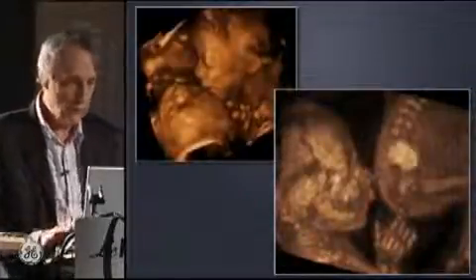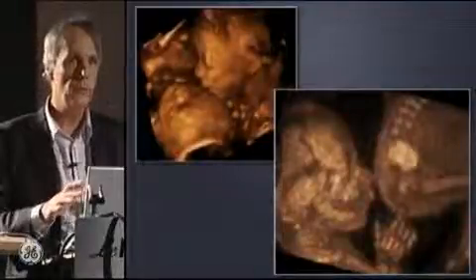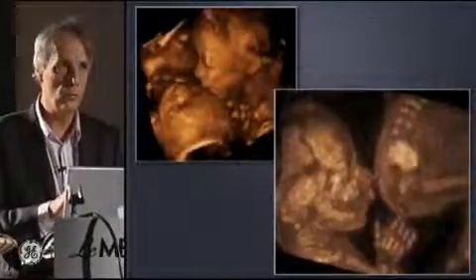So this was a lecture on the use of 3D ultrasound in obstetrics, but especially in the second trimester of the pregnancy. Now I will show you what is possible to do in the first trimester of the pregnancy. In the first trimester, the main difference is you can obtain the complete fetus inside one block. And in the second and third trimester, you can obtain only a part of the fetus.